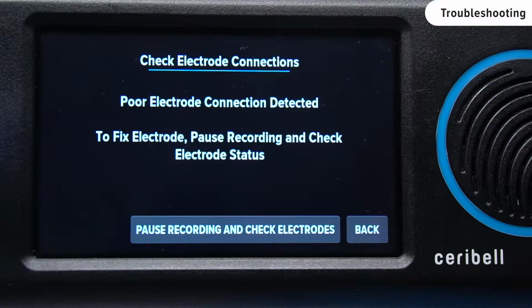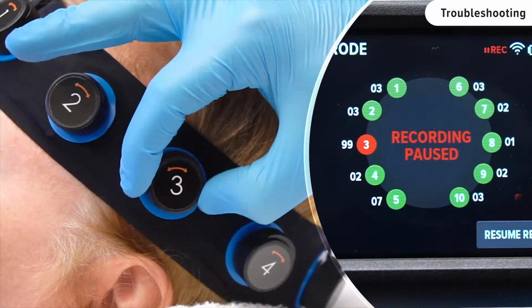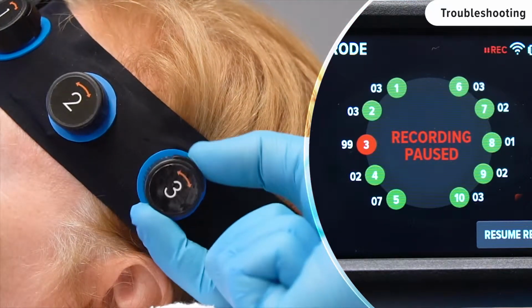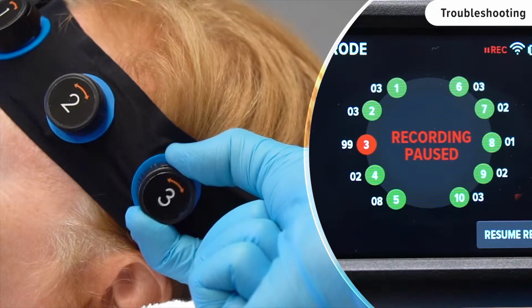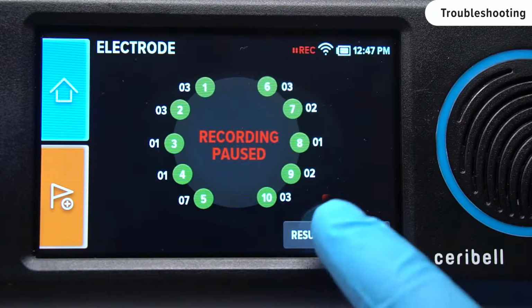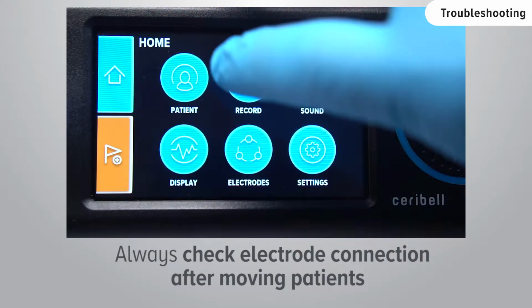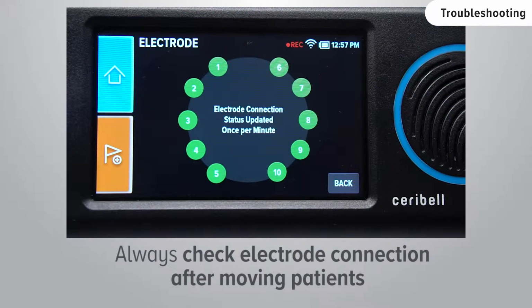To fix the connection, touch the Pause Recording and Check Electrodes button, and repeat the original steps for electrode preparation. Once all electrode connections are fixed, touch the Resume Recording button. Note that it is important to always check the electrode connections after moving a patient.